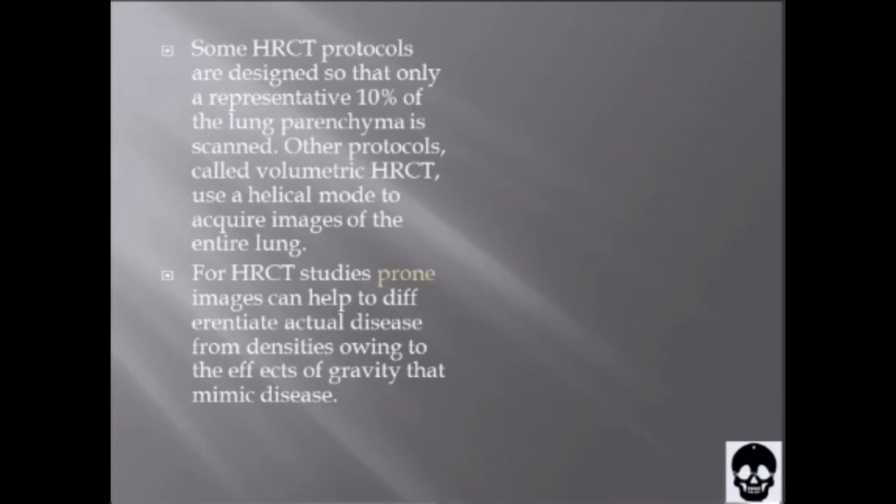Although there are clear advantages to the use of volumetric high-resolution CT over an interspaced technique, the increased radiation exposure is a consideration. Many volumetric high-resolution CT protocols decrease the tube current, mA, to reduce the radiation dose.